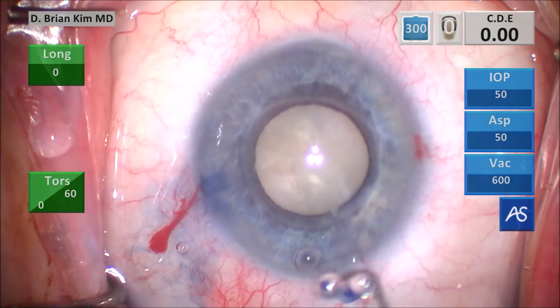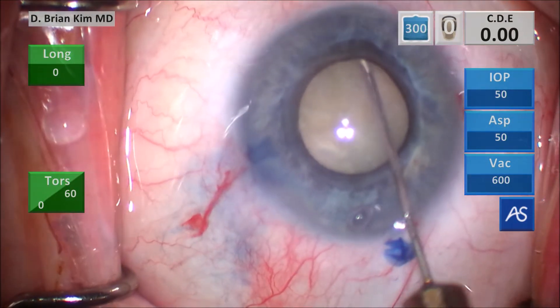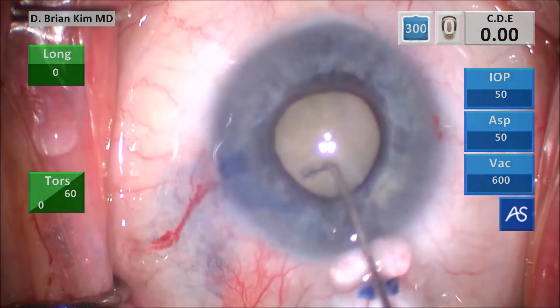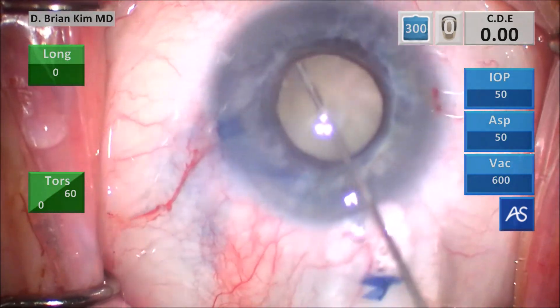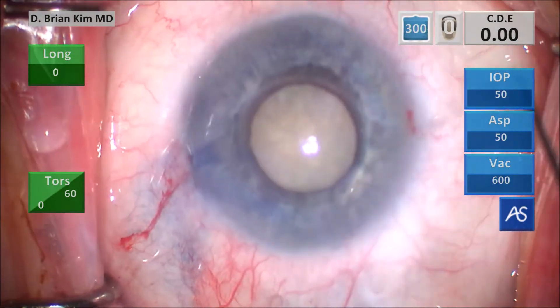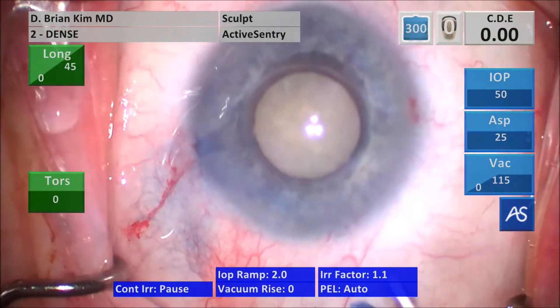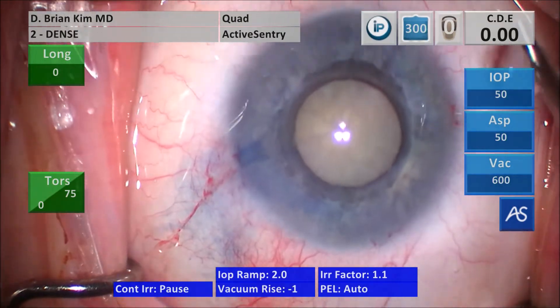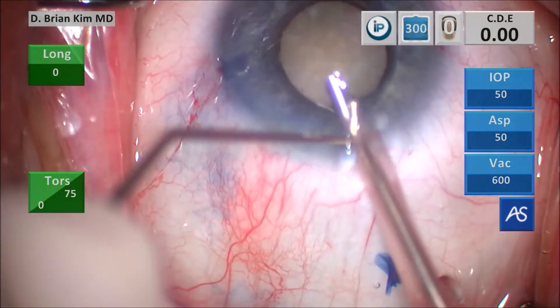This is a capsule fornix hydrodissection technique — I place a cannula under the rhexis edge contra-incisionally, point the tip down. You can't see the wave of course because it's a white dense cataract. I decompress the bag, sweeping on the left side and then the right side, and the lens begins to spin. As I've said many times, with white cataracts the cortex is fluffy and the epinucleus is fluffy — in this context the lens is typically not attached to the posterior capsule or the capsular bag.